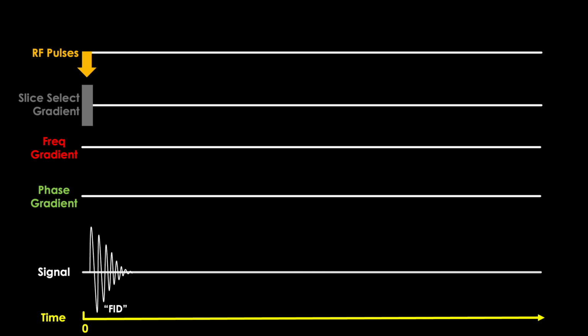We showed in the phase encoding lecture that issues arise when we try to apply both of them at the same time. So we denote the gradient we vary throughout the image capturing process, the phase encoding gradient, shown here by these green boxes, as the gradient we apply to our free induction decay. We'll explain what these boxes mean later in the lecture.